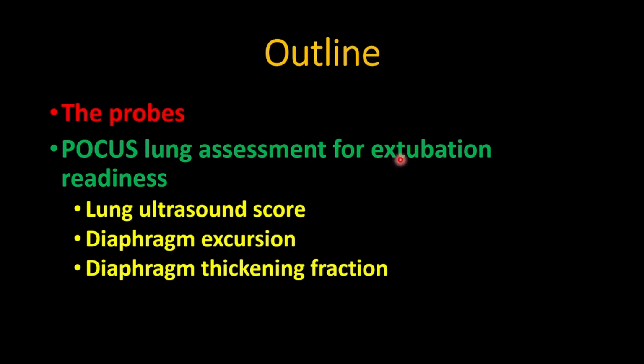This is the outline of the talk. We talk about a little bit of the probe and the basic POCUS lung assessment for extubation readiness test, which covers the three important features that we're looking at: lung ultrasound score, diaphragm excursion, and diaphragm thickening fraction.